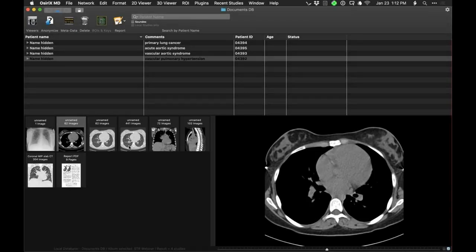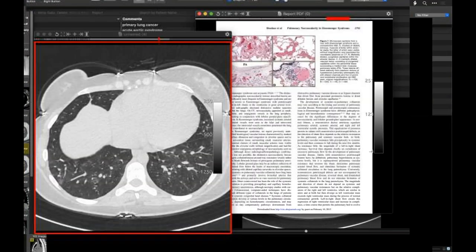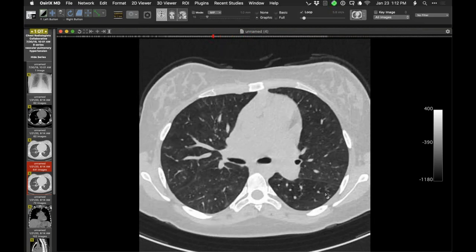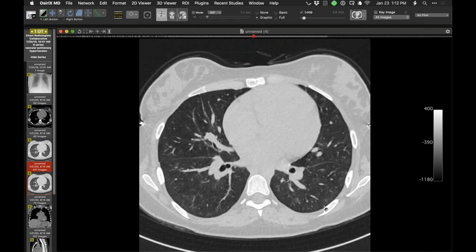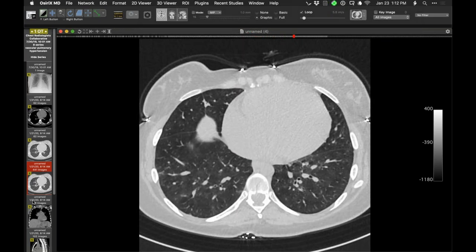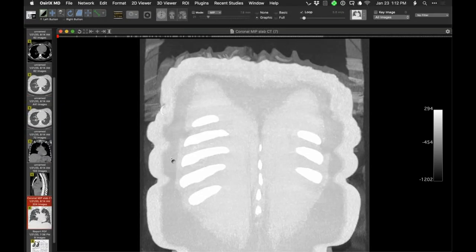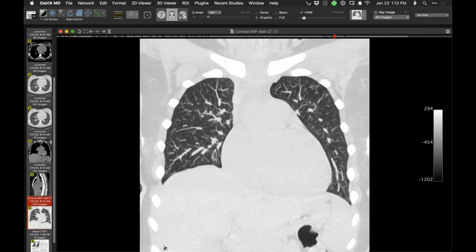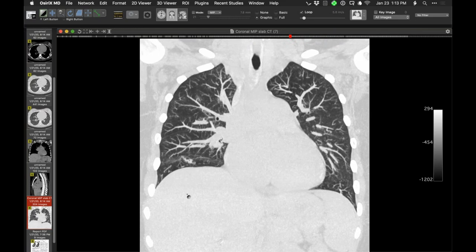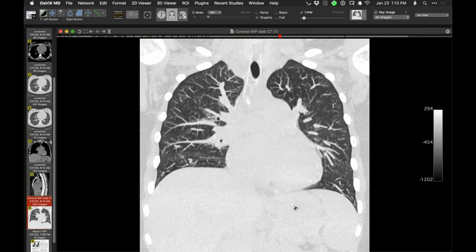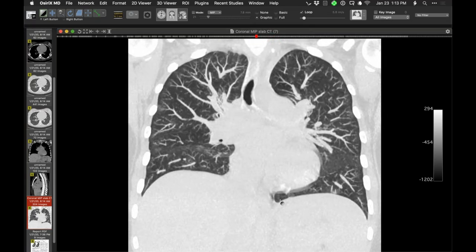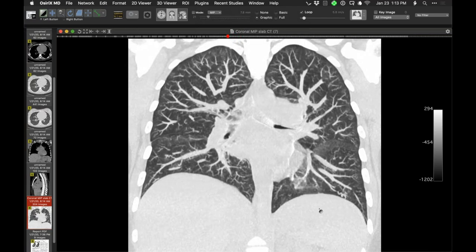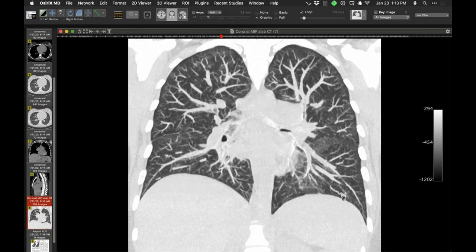So that's what I think this person has. What's really conspicuous — in addition to the mosaic attenuation and the ground glass — are the very tortuous corkscrew pulmonary vessels. I'll scroll through and stop in areas where these corkscrew vessels are rather conspicuous in relation to the smaller pulmonary arteries. Here's one in the right middle lobe — a very corkscrew-y vessel. Some people call these Sheehan vessels. This person has nice examples of both findings in the lungs.